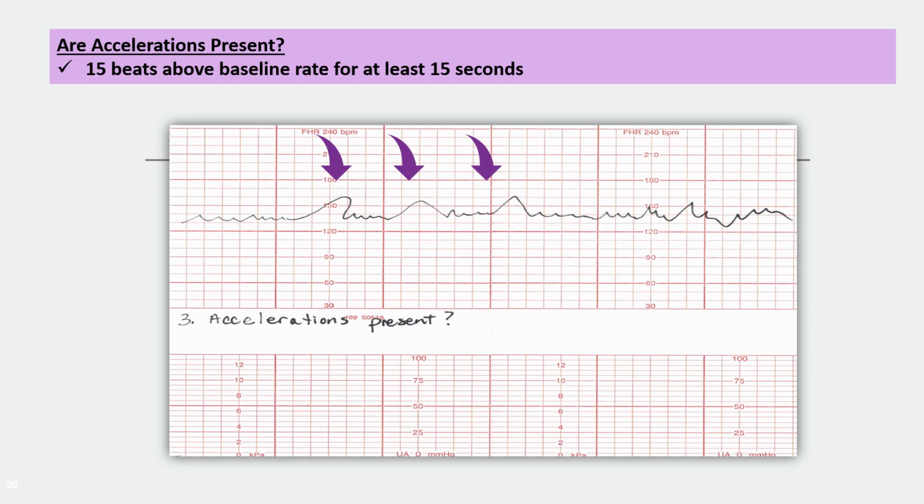Now, we talked about non-stress tests. These are indicated for patients that have hypertension, some other kind of condition in the pregnancy where we're doing fetal surveillance. Diabetes is another one. So if they have at least 2 accelerations in a 20 to 40 minute window of time, that's considered a reactive NST. And we know that with a reactive NST, which is good for about 3 days, we have a very, very low likelihood of stillbirth. So that's why we do these. And we usually do them twice a week because they're good for about 3 days. So this is just part of antepartum surveillance.